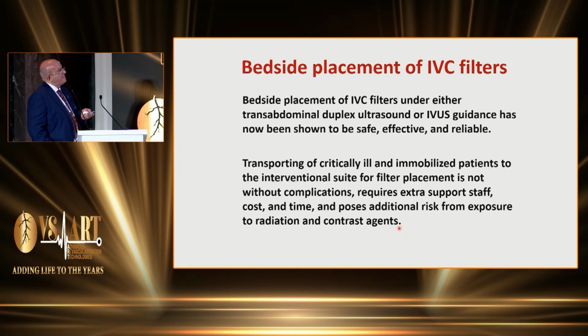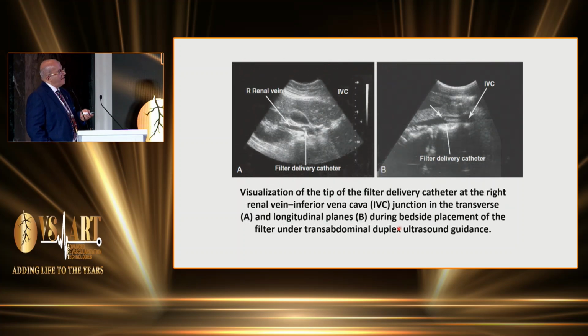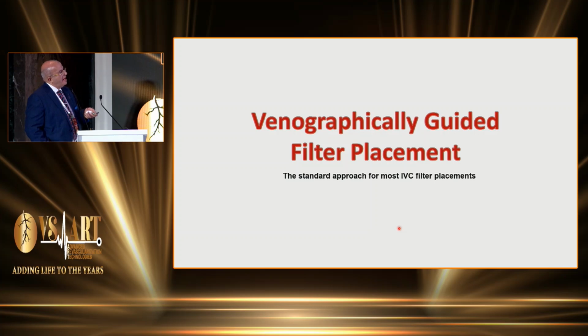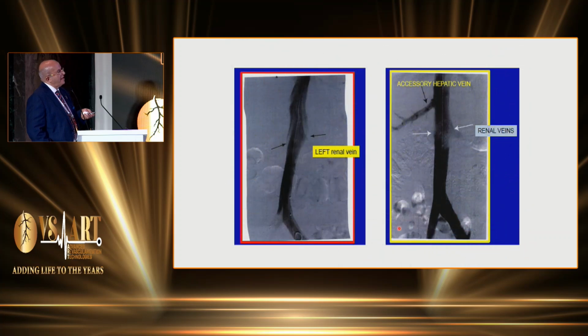Bedside placement of the IVC filter: sometimes the patient is in the ICU and movement is dangerous for the patient, so we can insert the filter using duplex ultrasound, when we see the tip of the filter under duplex ultrasound guidance. Venography-guided filter placement is the standard approach for most IVC filters. This is a non-selective venography depending on the level of the bones.